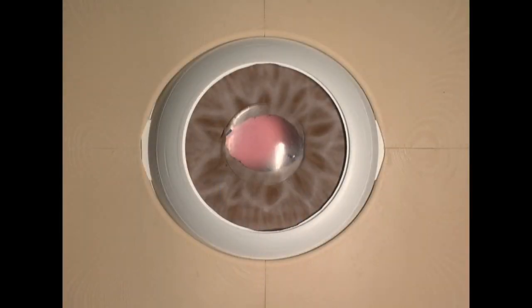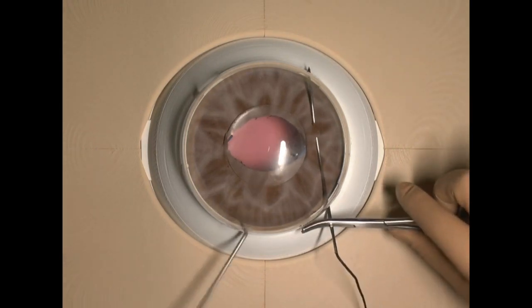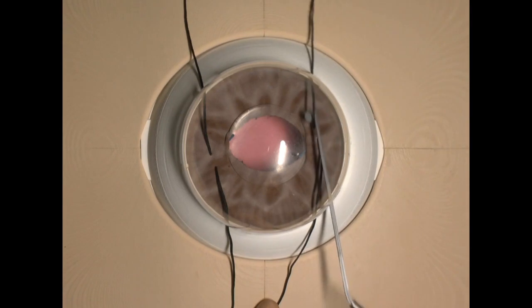When fixating the haptics of three-piece lens by suture to the iris, we keep the optic of the lens anterior to the iris and replace it retropupulary after finishing both Sipser slipknot.